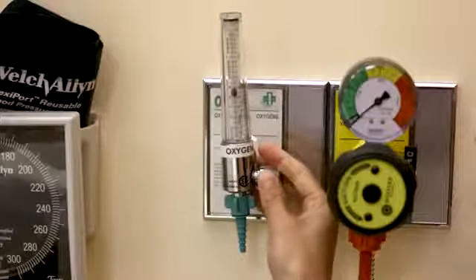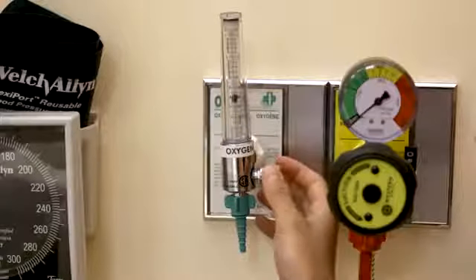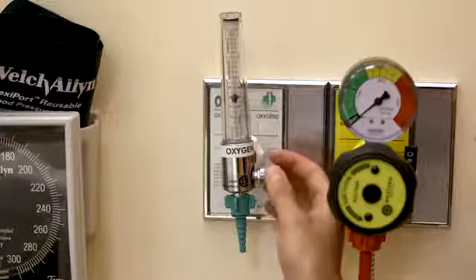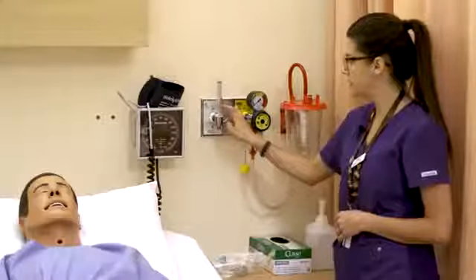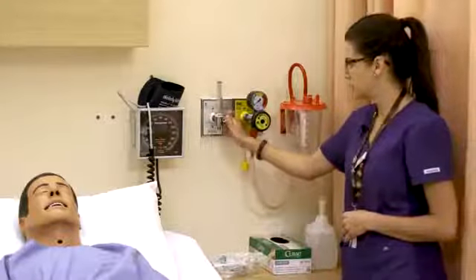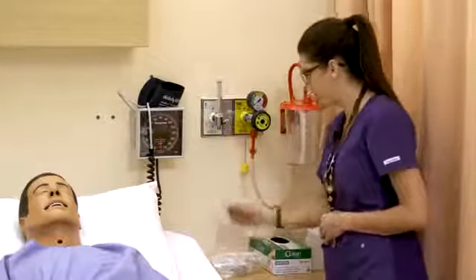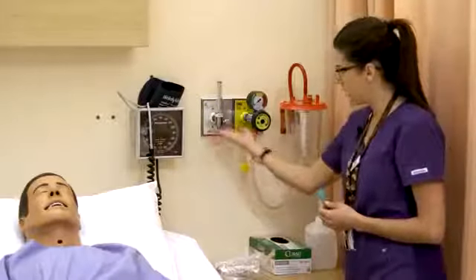How we know how many liters per minute is the number we go to when it cuts the ball right in half. Right now the ball is cut off at the 2 line, so that's delivering 2 liters per minute of oxygen. We'll just turn it off right now for sound.